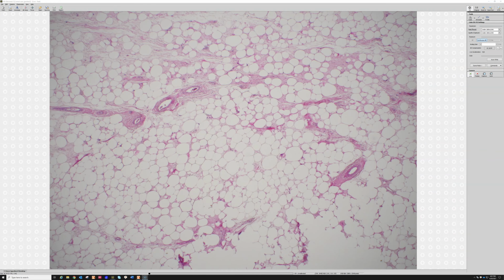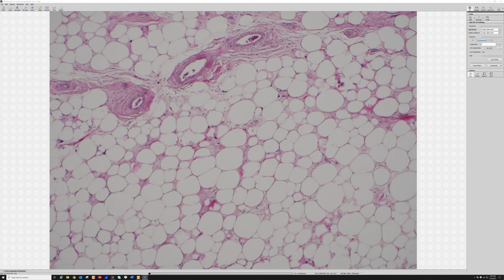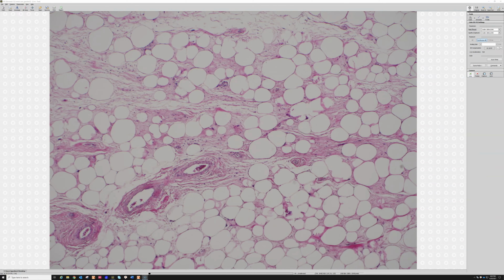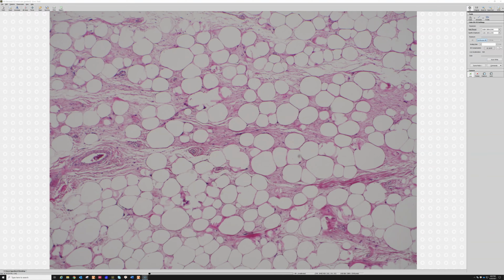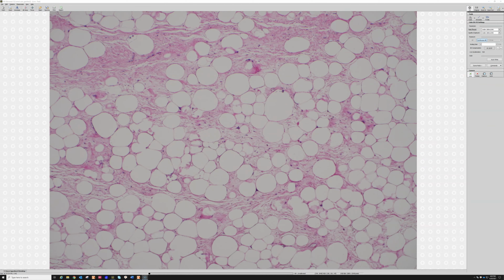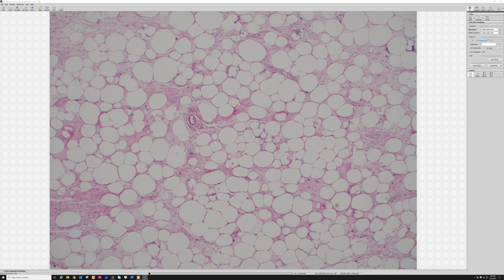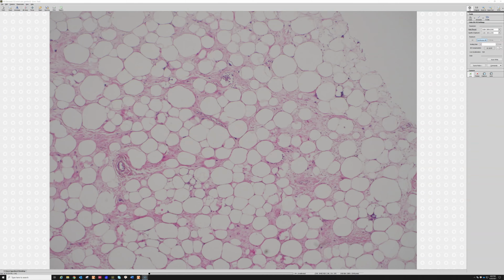Now, there are immunostains for MDM2 and CDK4. I just find them more challenging to interpret, but I know some really great soft tissue pathologists who like them, and some people use them as a screen, that if they're negative, then that's a good sign that it's not well-diff liposarcoma. If they're positive, then you can proceed to FISH to help confirm it. In a case like this, the clinical history of a large mass in the retroperitoneum and the microscopic findings are just classic, and I personally would sign this case out, and in fact, I think I did sign this out on H&E alone with no special stains, no FISH or anything. So in any case, you do, of course, as always, have to make sure that it all makes sense.